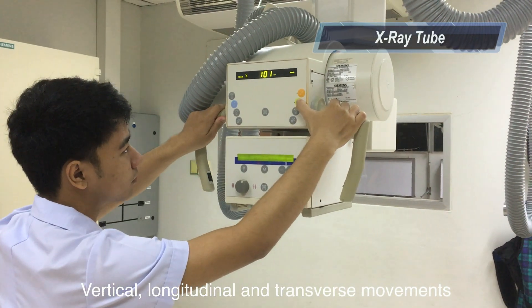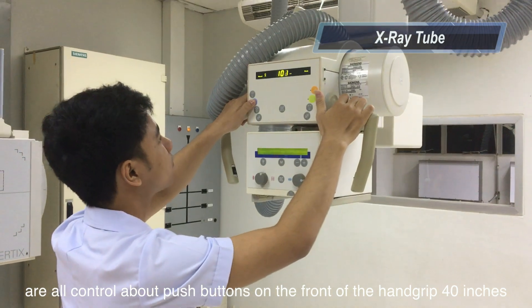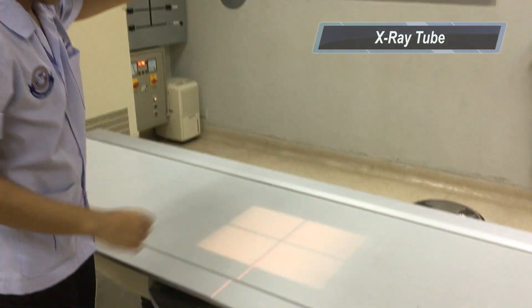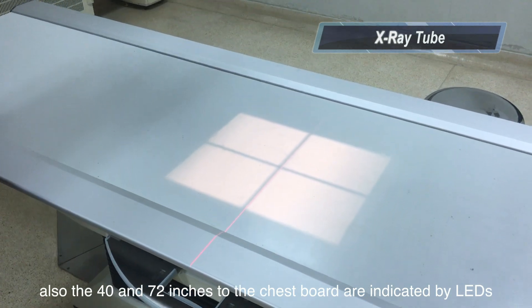Vertical, longitudinal, and transverse movements are all controlled by pushing the buttons on the front of the hand grip. The 40-inch SID to the Bucky tabletop is indicated by LEDs. Also, the 40 and 72-inch SID to the wall stand are indicated by LEDs too.